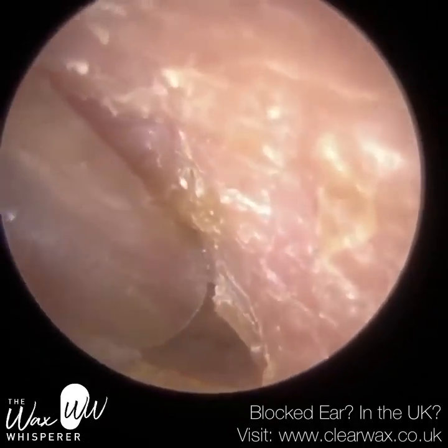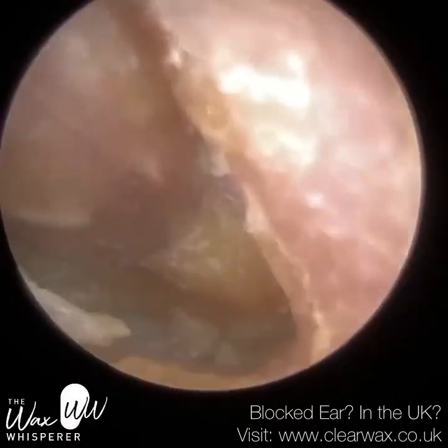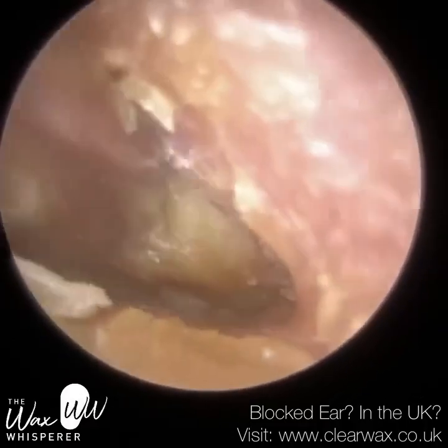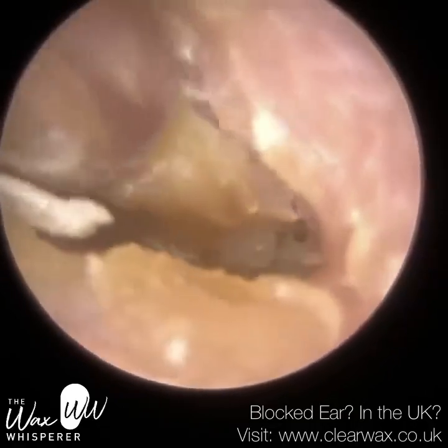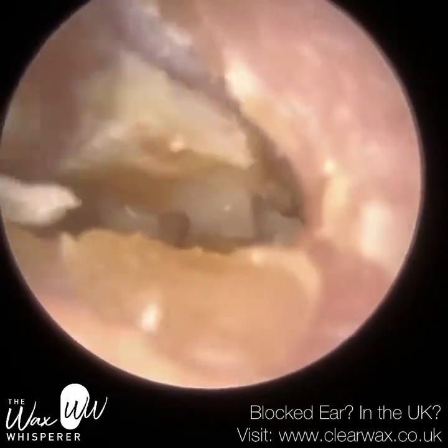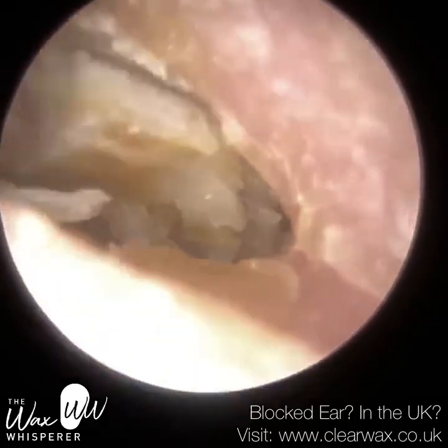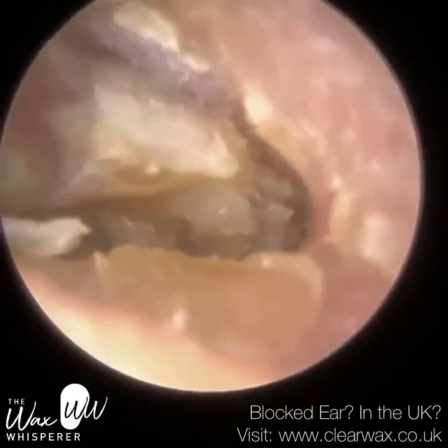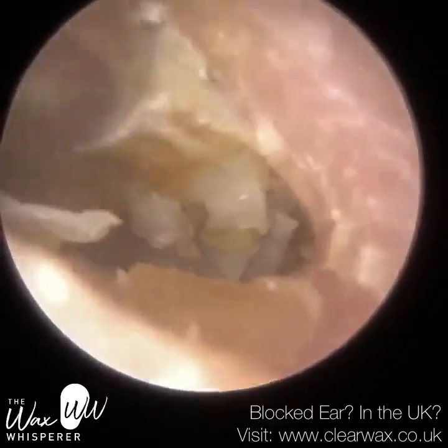We have here a very complex case of a patient who needs to attend quarterly to have both their ears cleaned. I'm just commencing with their right ear, and believe it or not, this is the better ear out of the two. However, this ear is extremely complicated for the primary reason that they suffer from otitis externa. Now, otitis externa is an infection or inflammation of the outer ear.